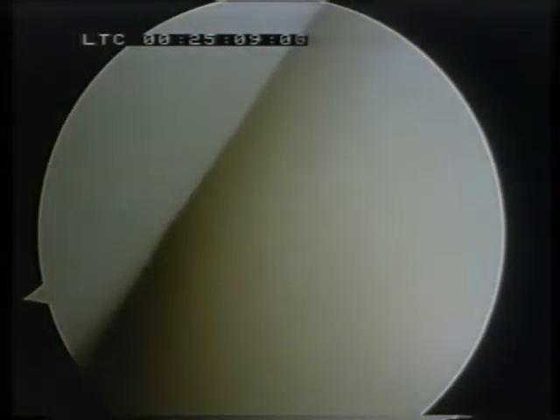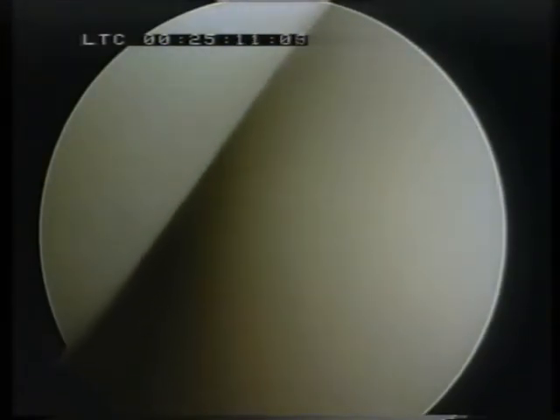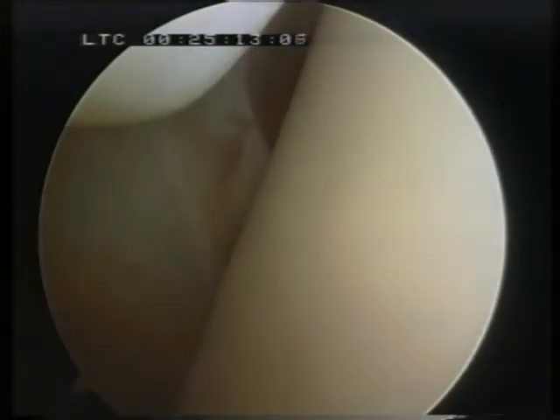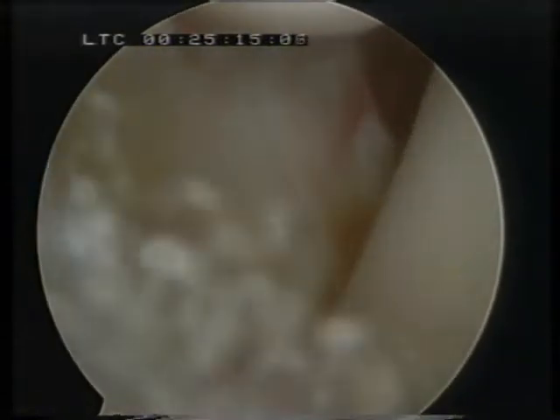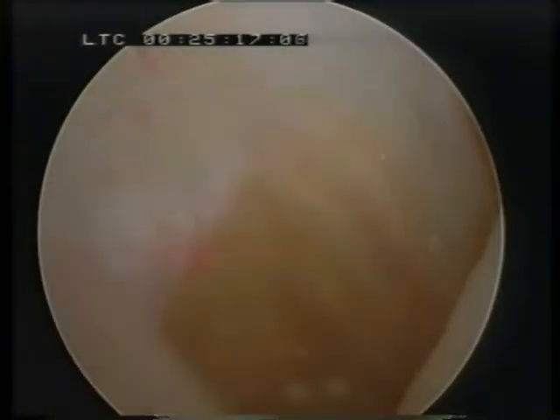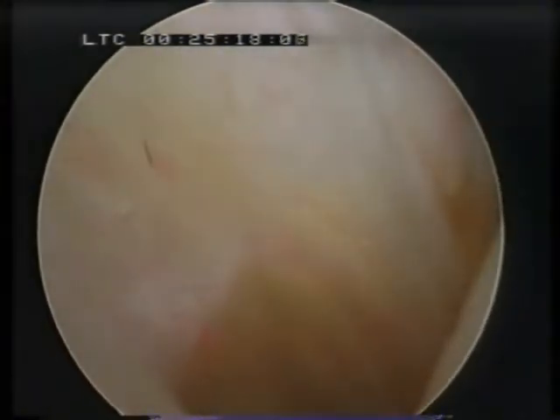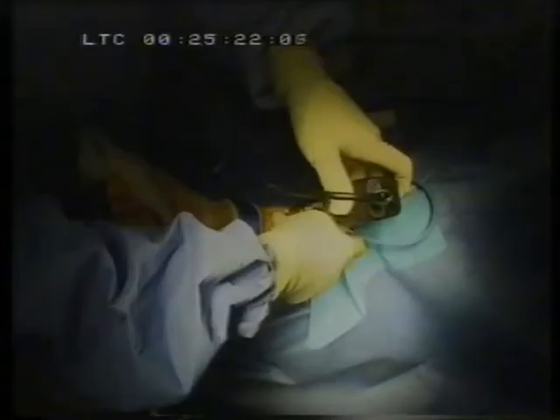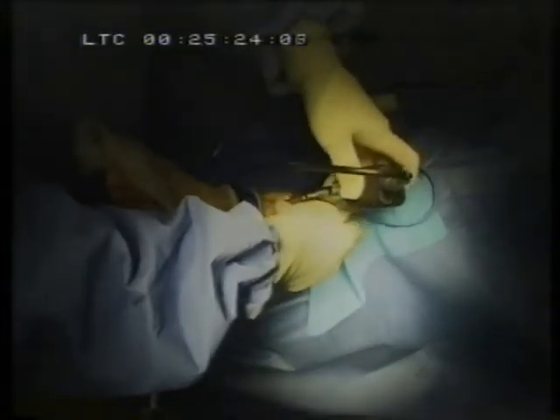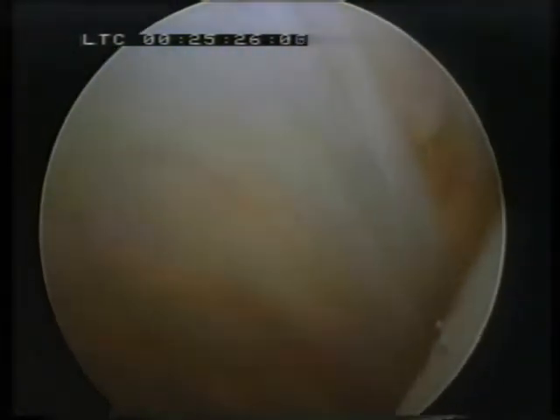In order to inspect the medial side of the joint, you can see there is some synovitis getting in the way of the scope. You can pass the scope down the medial gutter, and because we're using this 1.9mm scope, you can actually get into the corners quite well. Once we get down into this zone of the ankle, you can see a little bit of synovitis.